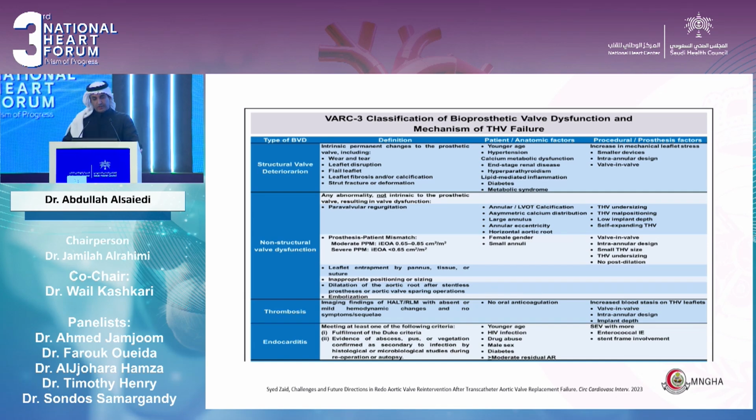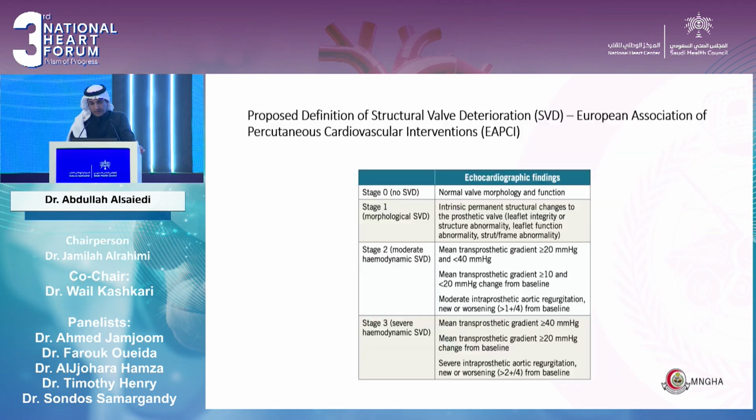So generally, this is what the guidelines say about the classification of bioprosthetic valve dysfunction. Regarding the mechanism, we can classify the dysfunction into four causes: usually causes related to structural valve deterioration or related to non-structural valve deterioration, which include patient-prosthesis mismatch, or thrombosis and endocarditis.